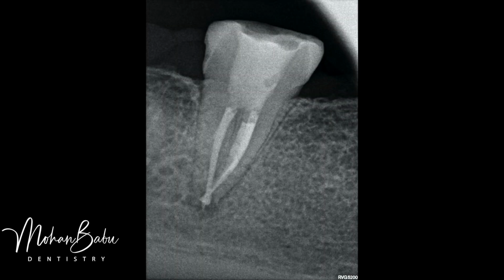And now we continue with our routine cleaning and shaping. Surprisingly, the distal canal is also joining the mesial canals. Now all three canals are joining together. Master cone selected and obturation done. The patient is sent back to his own dentist.